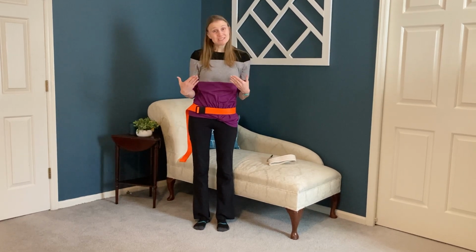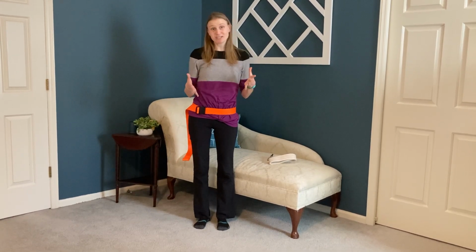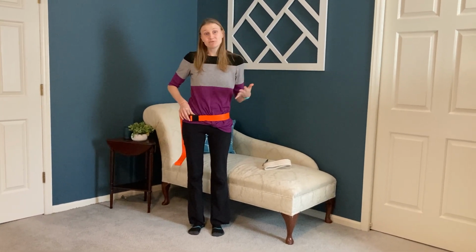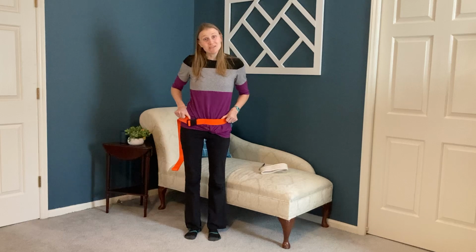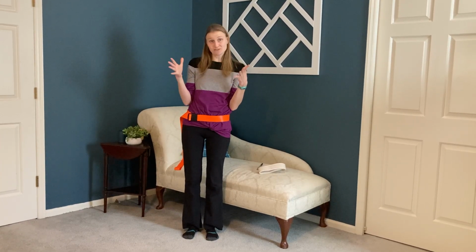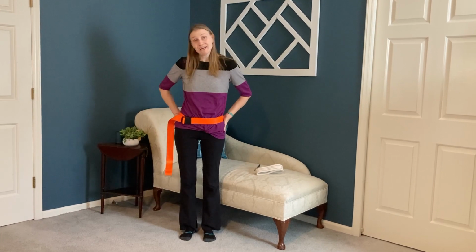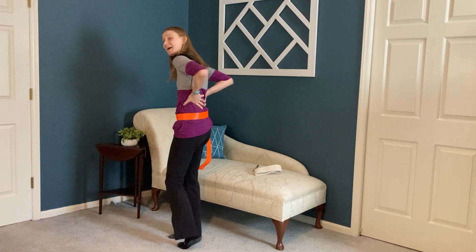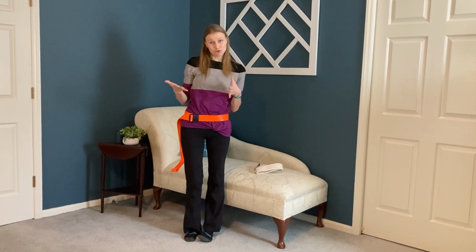My personal preference, if I am helping someone with lifting or transfers, is that I actually prefer not to use a gait belt specifically for that reason. It moves even if it's tight. I prefer to use my hands, so if I am going to lift or transfer someone, I'm either going to go for hands on the hip bones or hands around underneath here and holding behind the ribs. I feel like I have more control that way.